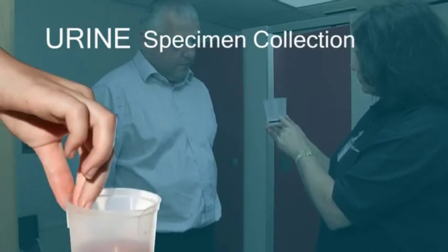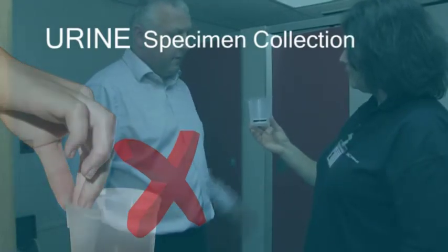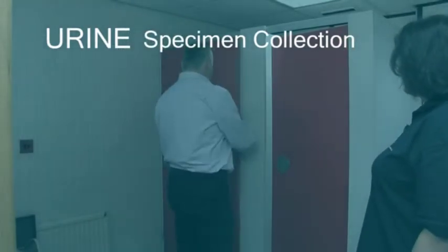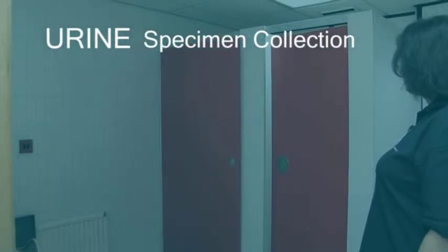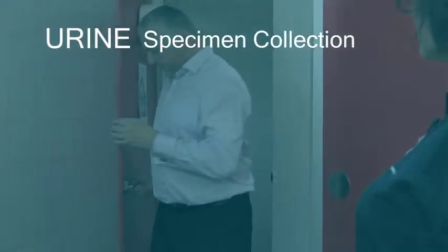Do not put your fingers in the cup. You could be accused of contaminating the contents. Now, hand the cup to the donor. Wait outside, but always within sight and sound of the cubicle door. Being within sight and sound of the collection will allow you to pick up on any unusual behaviour or telltale signs of anything suspicious. As soon as they come out of the cubicle, take the collection cup and check the temperature strip.